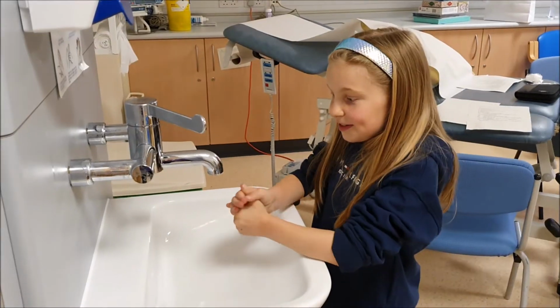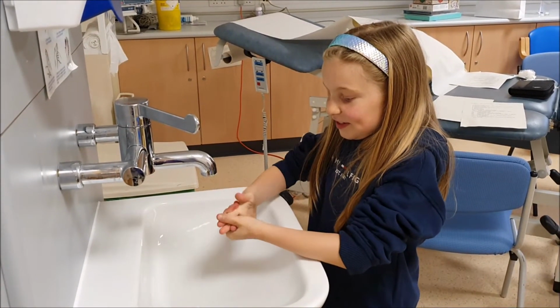Hello, my name's Arabella and I'm 10 years old and I'm going to be showing you how to do your home test in INR. Now I'm going to wash my hands for at least 20 seconds.